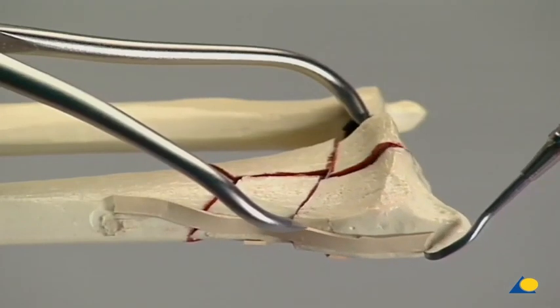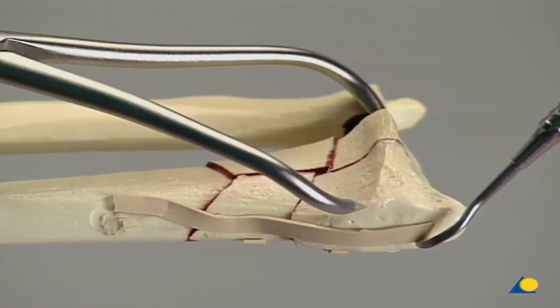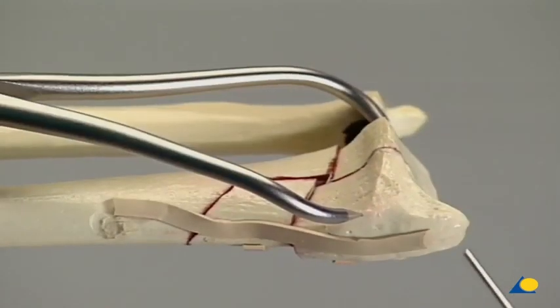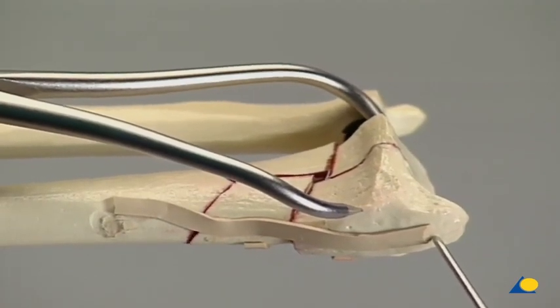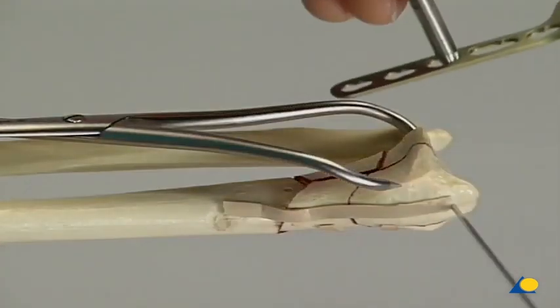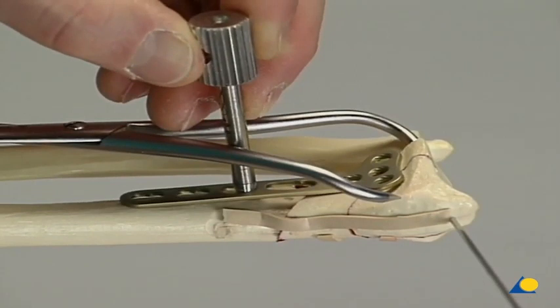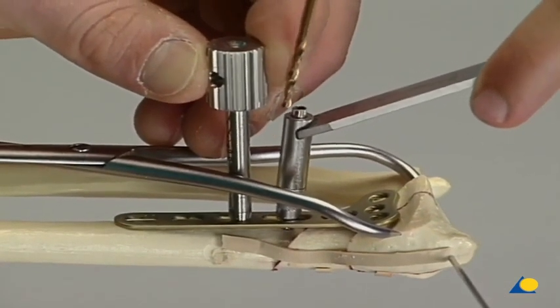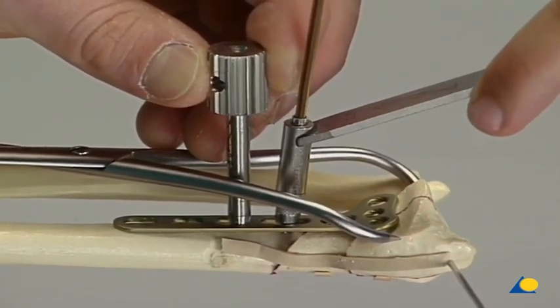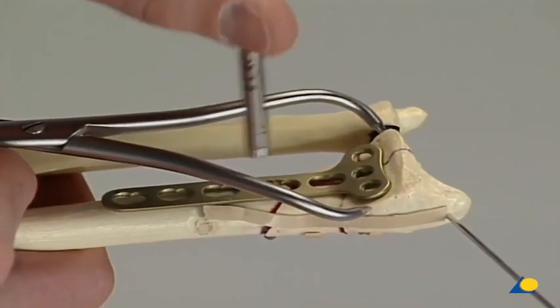The joint block is reduced and preliminarily stabilized using reduction forceps. Retention is by means of a K-wire. The selected five-hole 3.5 right-angled LCP T plate is inserted. The threaded drill guide can be used to manipulate the plate. The plate can be pulled towards the distal shaft and fixed using a cortex screw inserted through the oval hole of the plate. The threaded drill guide is then inserted into the distal T arm.